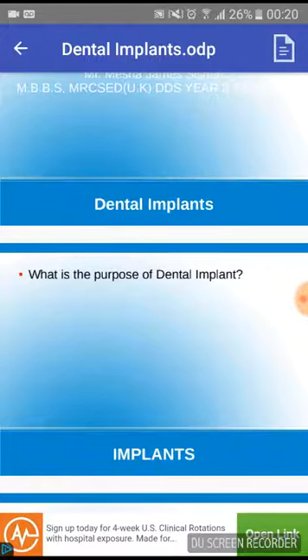So as most persons who have done any form of training in surgery know, once you place an implant of any sort, especially on bone, you need to do a post-operative x-ray to see if it's placed correctly. So an x-ray is taken of the area to check the position, and the gum is then stitched. And this procedure usually takes about an hour or less.